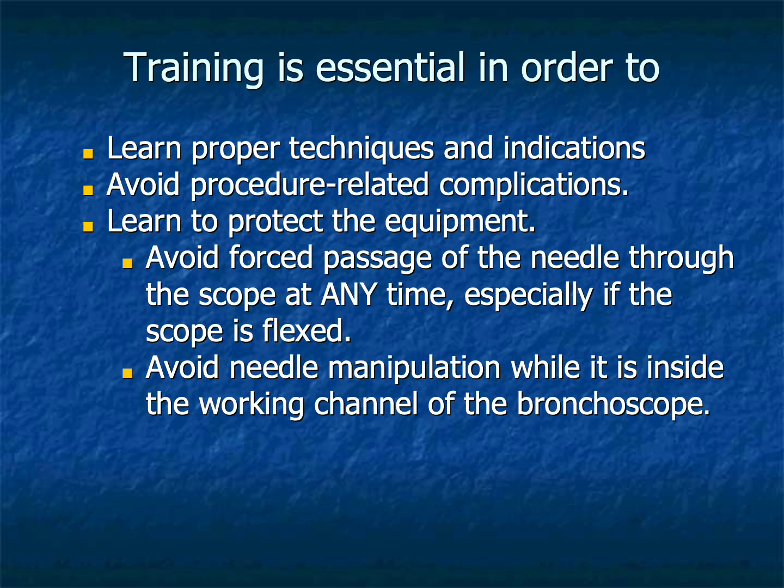Technical training is particularly important with needle aspiration procedures. Unlike forceps biopsies, the operator is advancing a sharp instrument through the bronchial wall toward structures that cannot be seen directly. Proper training, therefore, emphasizes more than obtaining diagnostic tissue.